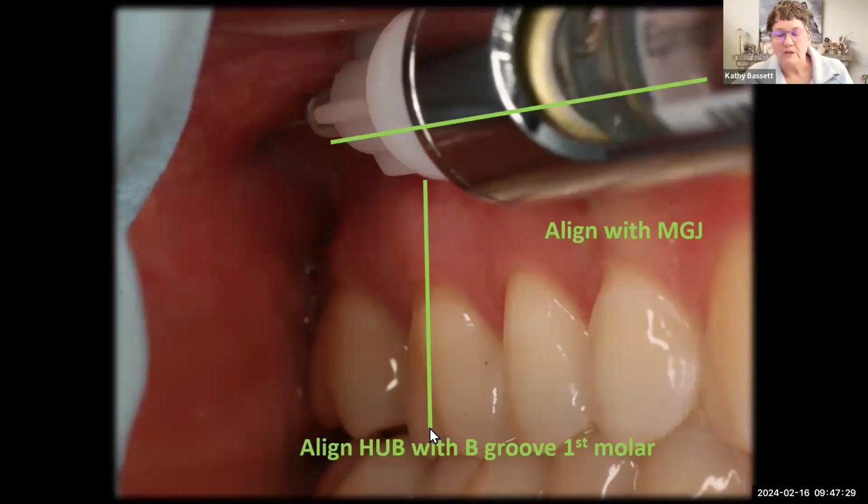And then the other thing is to be sure to orient the face of the bevel towards the teeth, because with our basic physics, needle tips move away from the bevel. So if I orient the bevel towards the teeth as I insert, it's going to turn the bevel towards the ramus and make that internal curvature. Some people like to bend the needle to do that. I'm not a big proponent of bending needles for any purpose other than maybe a PDL, but when you use that principle of physics, it's going to make that same curvature all on its own at the depth of this insertion.